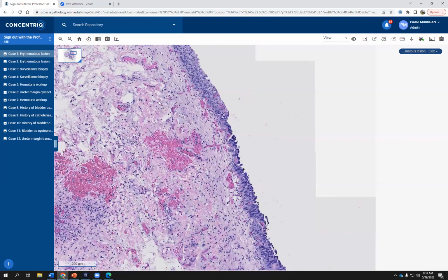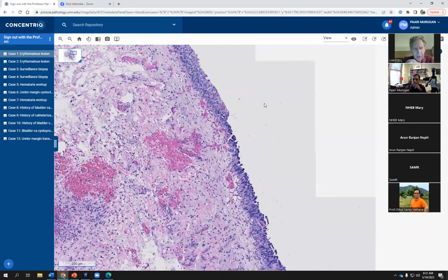Yeah, very good. One other question about P53 staining. In some of the other organs where I spend more of my time, we recognize several different patterns of mutation-related staining, and particularly the null type, which may have been one of the stains that you showed there with the negative staining. I have often been inclined to use P16 as a marker for that circumstance where you have a null mutation and may find the staining very weak. Have you ever tried that or used that in the bladder?